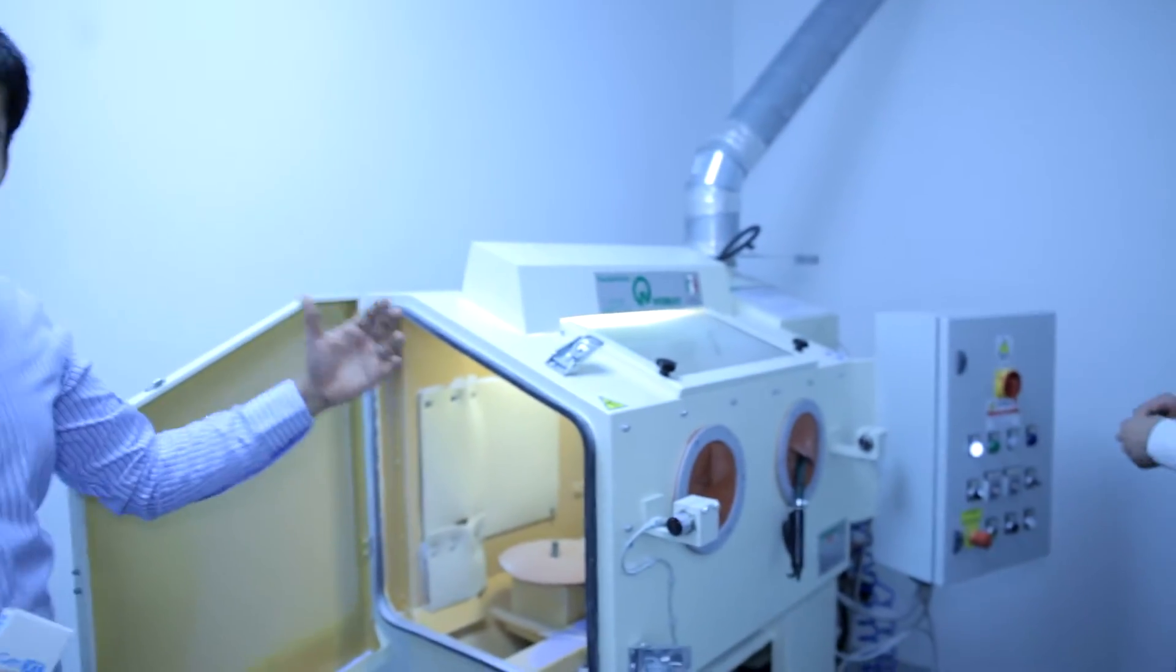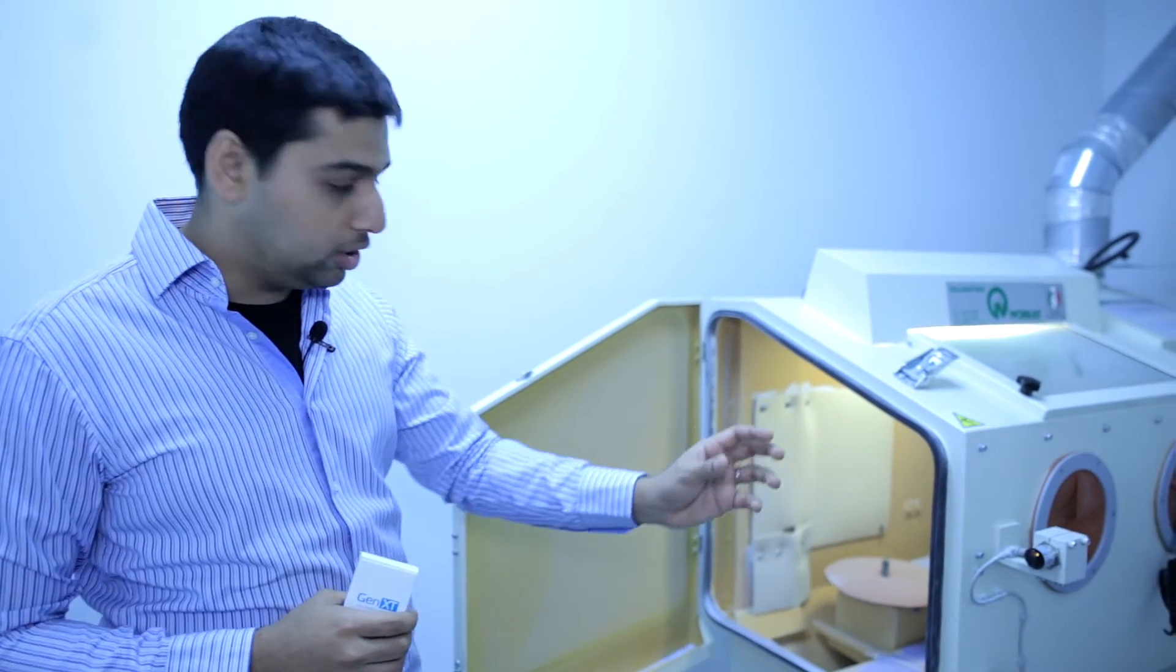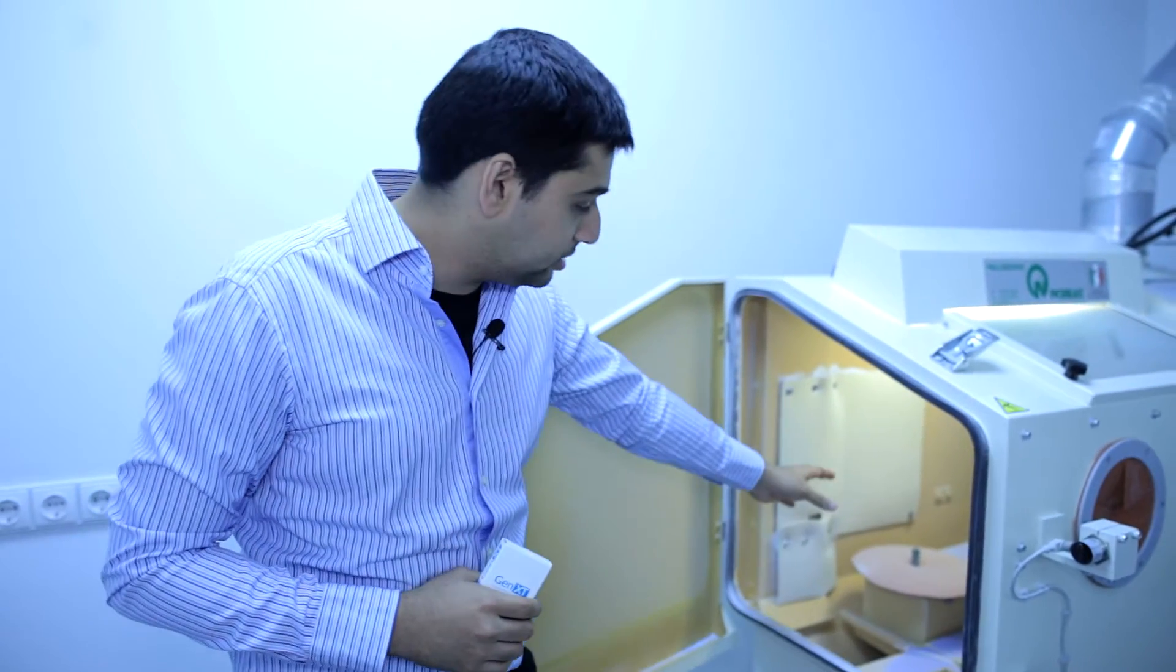So this is an automated sandblasting machine. This is the first step where the surface treatment will start. Unlike a lot of companies that do it via a hand, this is completely automated. They have a jig into which the implant, a single implant is placed inside.